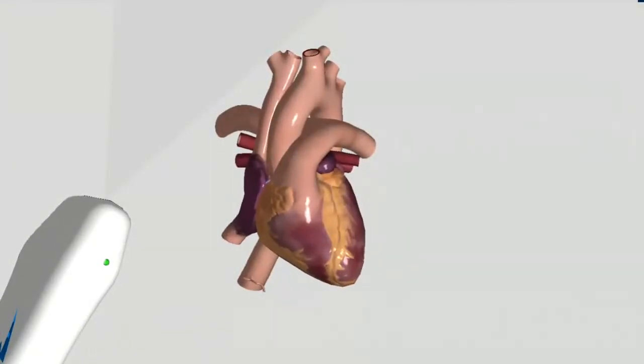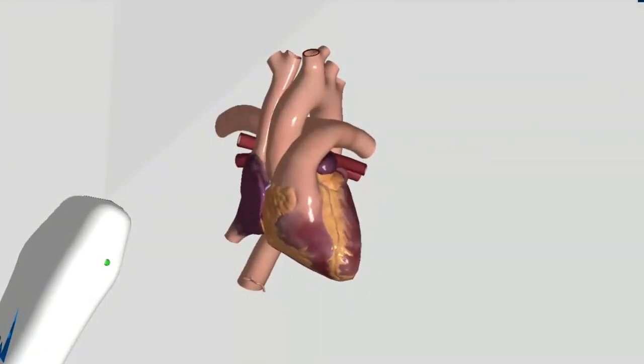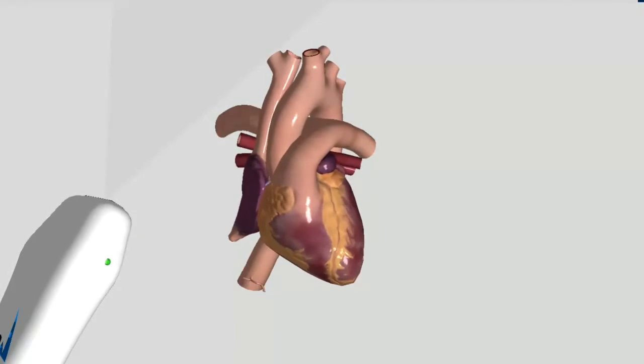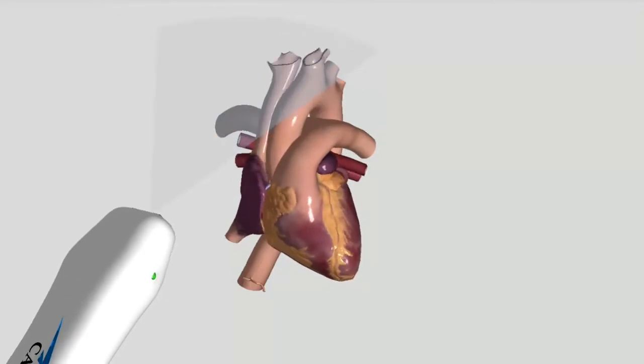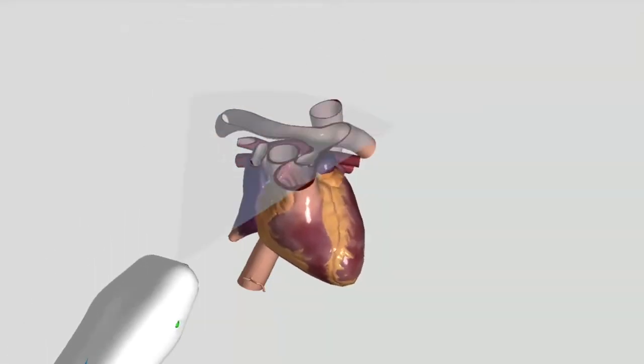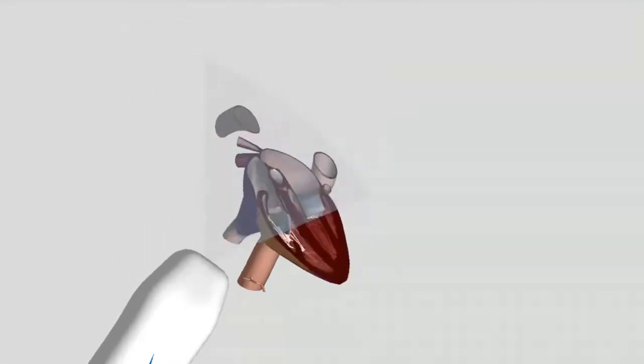This is going to be a walkthrough of basic cardiac anatomy using the CAE Vimedix Ultrasound Simulator. I'm going to use this simulated ultrasound wand on the left that is normally used to learn ultrasound techniques, except here instead we'll be using it to explore the anatomy of the 3D heart model.